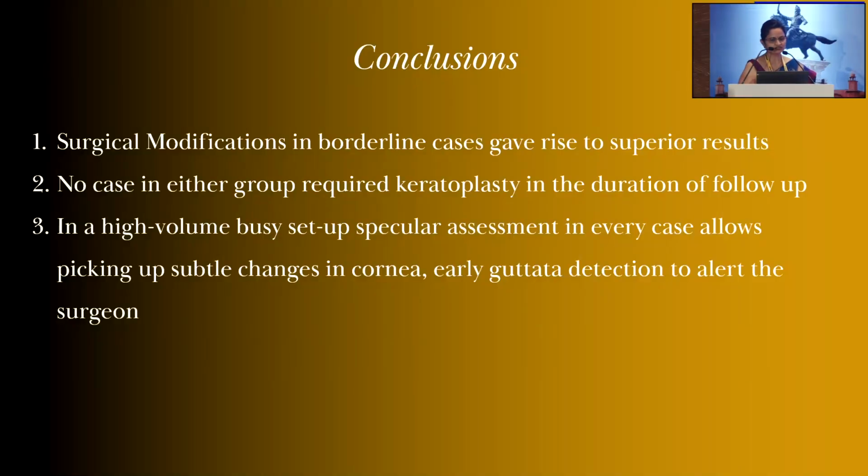Additionally, regarding the chondroitin sulfate that is used in viscoelastic devices, I think there may be some basic research required here, but it's actually helping the endothelial cells function better when it is being used, especially in these cases.